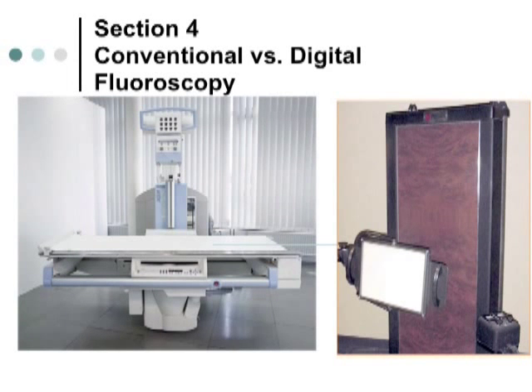Okay, if you'd like to, we'll continue on and start talking about conventional fluoroscopy. This is probably going to be the longest section I want to spend time on, and I'll explain how the fluoroscope works, and then also digital fluoroscopy and the difference between the two. Again, this is one of the old GE fluoroscopes. So this is the fluoroscope here, X-ray tubes behind, and this is connected to it and rotated up and down.